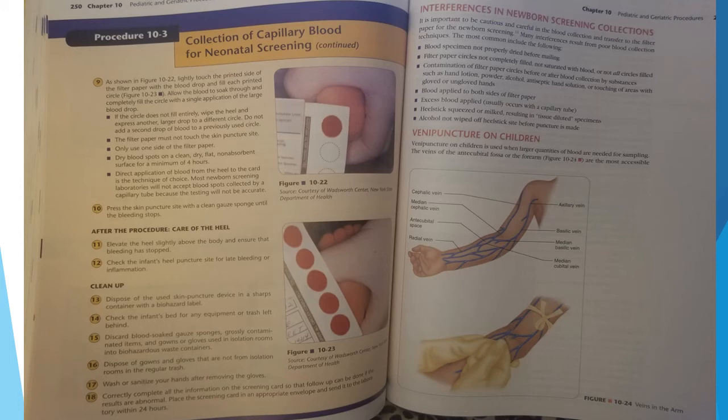As shown in Figure 1022, lightly touch the printed side of the filter paper with the blood drop and fill each printed circle. Allow the blood to soak through and completely fill the circle with a single application of a large drop of blood. If the circle does not fill entirely, wipe the heel and express another larger drop to a different circle. Do not add a second drop of blood to a previously used circle.